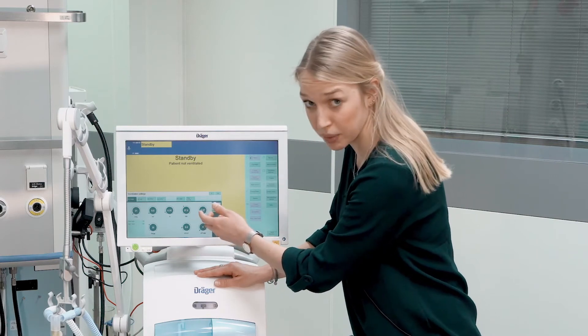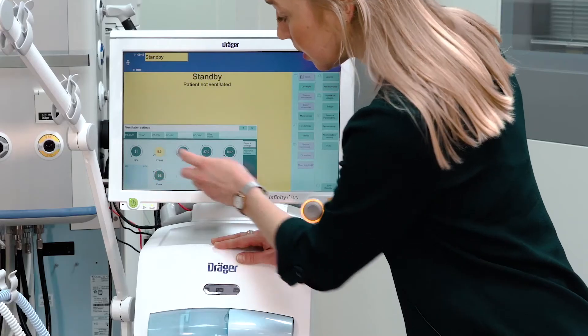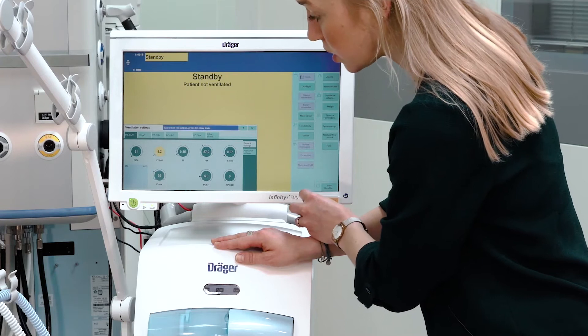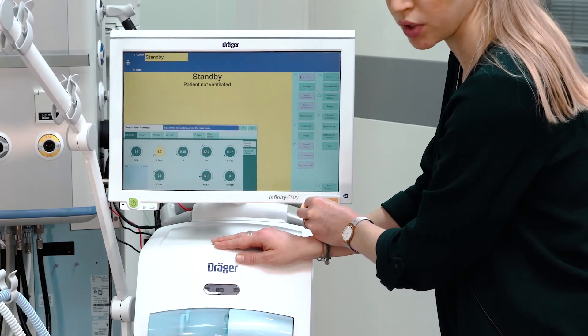To set a parameter individually, select the parameter, turn it to the desired value, and confirm by pressing the rotary knob.